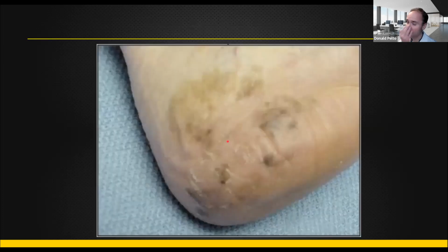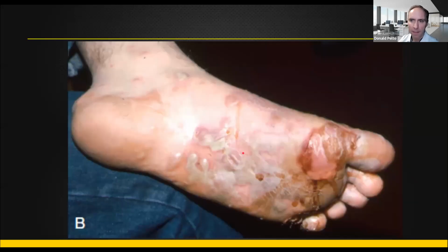And then this one here, dark lesion on the bottom of the heel. Thought it was just kind of dirty. I took two, and it came back as a melanoma. Then I referred this over to someone to excise that. I don't tend to excise these melanomas. I tend to send them out because they might need other things to be done.